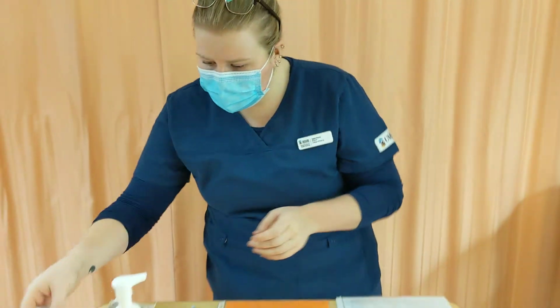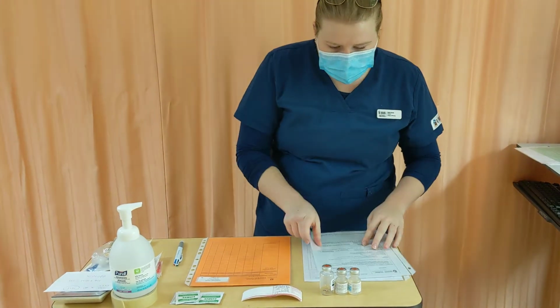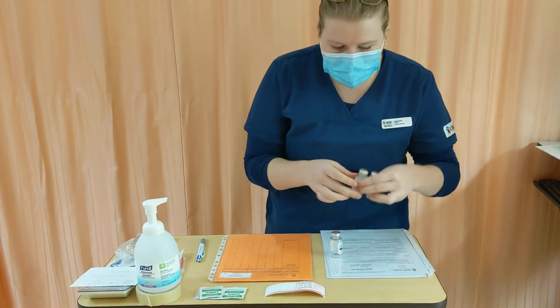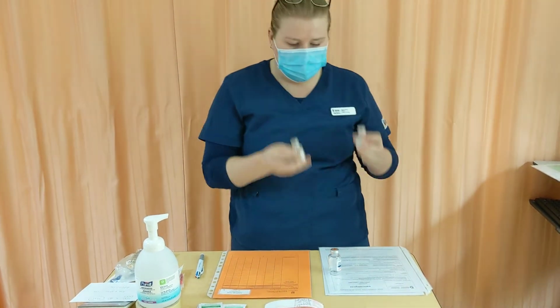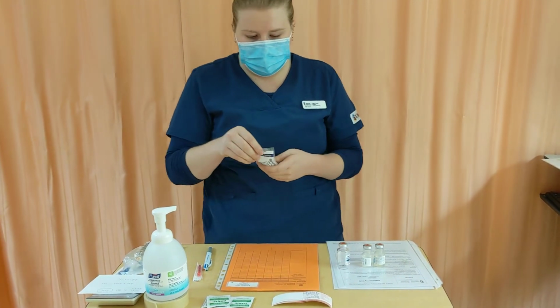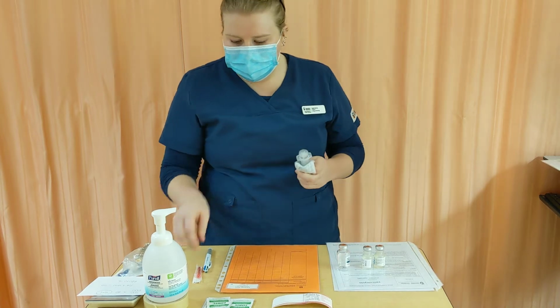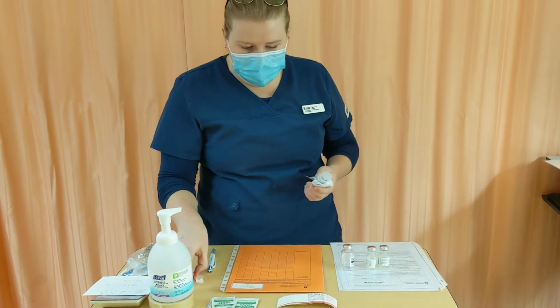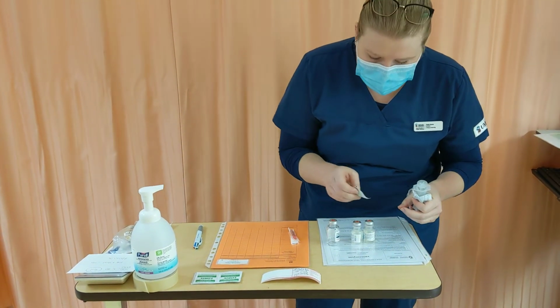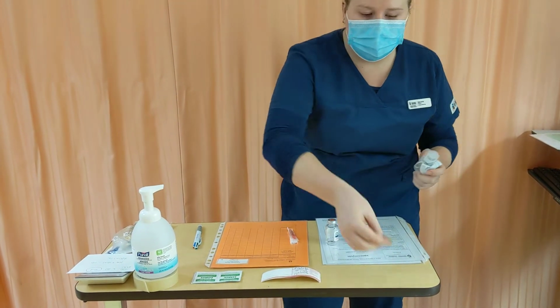After I've done that, I'm going to wash my hands and grab my drug that I've already checked for expiry, and I'm going to grab my 2 sterile waters. Both of them are not expired, so that's correct. I'm going to need 2 because they're only 10 mLs and I have to draw up 20 mLs. The next thing I'm going to do is wash my hands again, grab an alcohol swab, and swab the top of these for 30 seconds each in a circular motion and let them dry for 15.